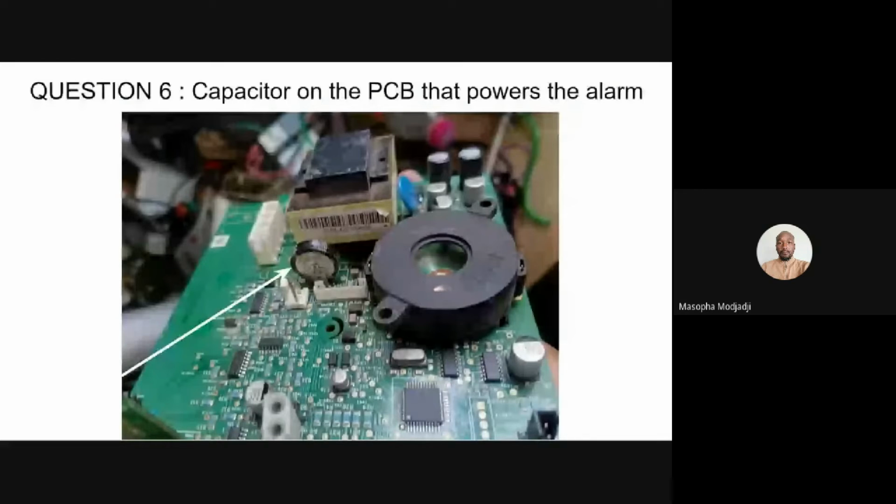Touch the multimeter leads to the corresponding leads on the capacitor. Connect the red to positive and black to negative since the capacitor is polarized. The multimeter should start at 0 and then move slowly towards infinity. This means the capacitor is in working condition.